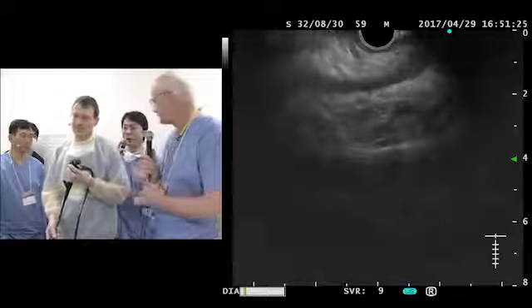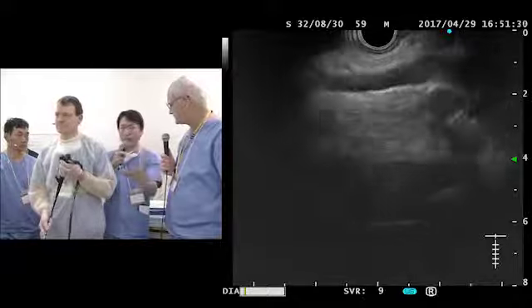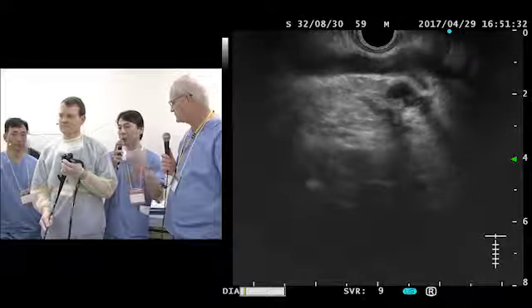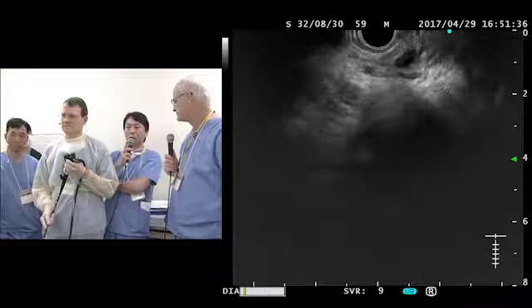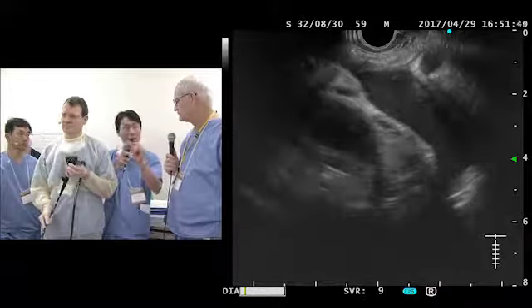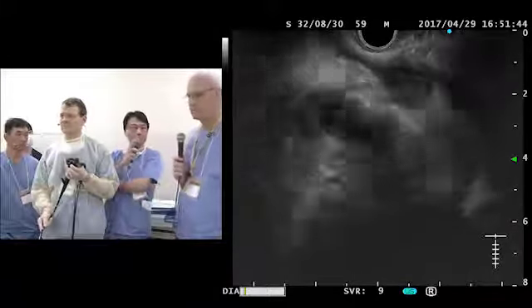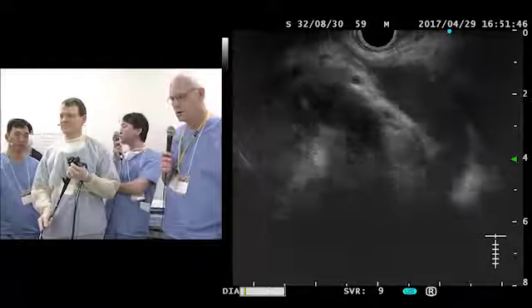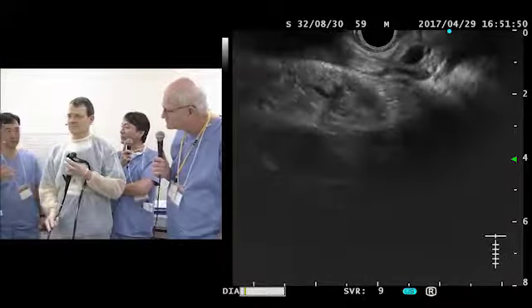I think in this situation in Japan, it is very difficult to go straight to the surgeon. Before that, we need cytology, tissue, pancreatic cytology. So we need to insert an ENPD tube and collect pancreatic juice for cytology. In the background, we're discussing what type of surgery he's going to need.